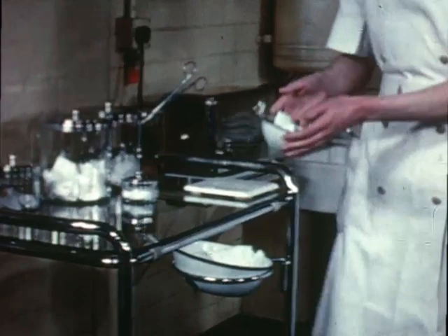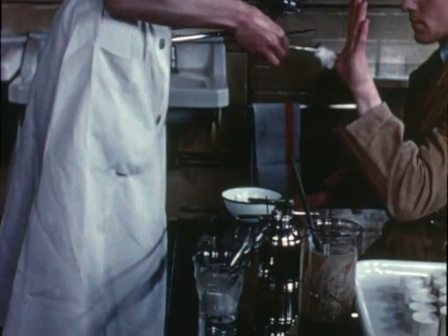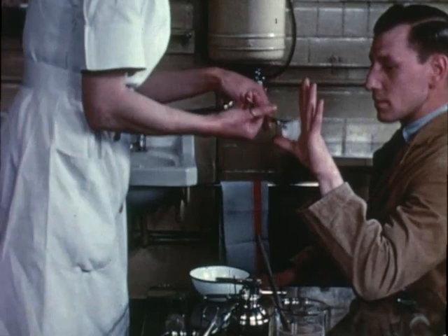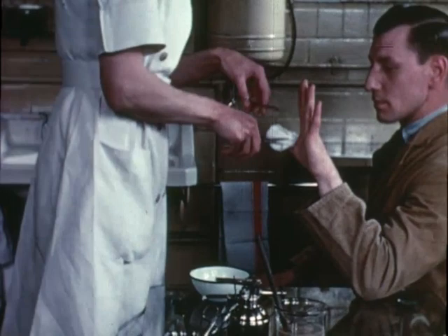The treatment and dressing of the wound is carried out with a strict non-touch technique. Notice that with two pairs of forceps, one can be used to steady the patient's finger while the wound treatment is being carried out with the other. The new gauze dressing is put on, covered with another larger piece of gauze, and then the wound is bandaged firmly.